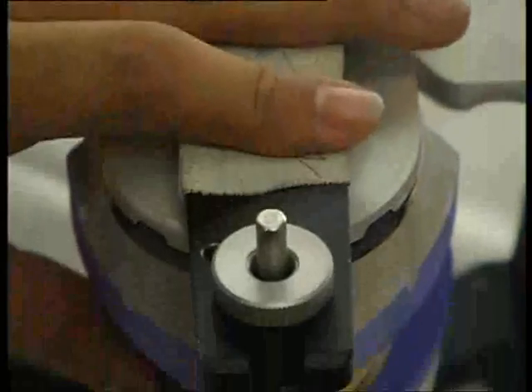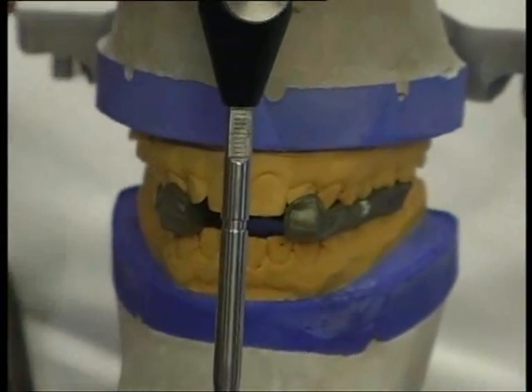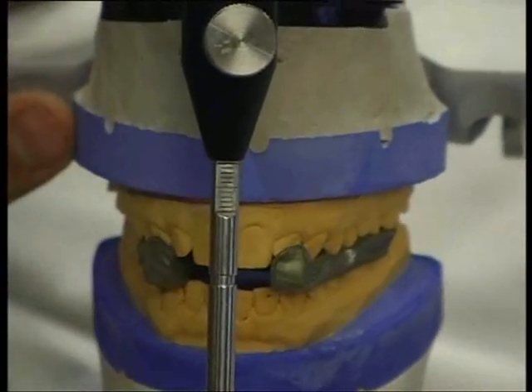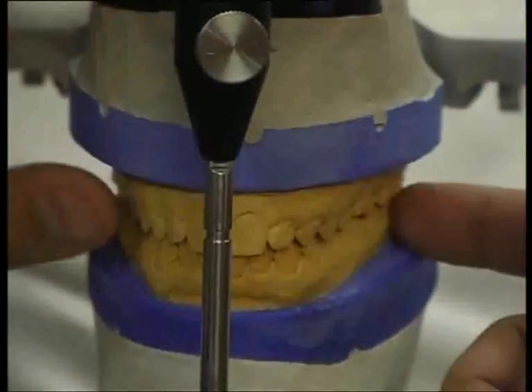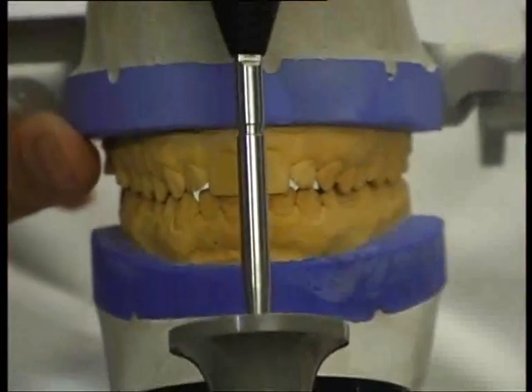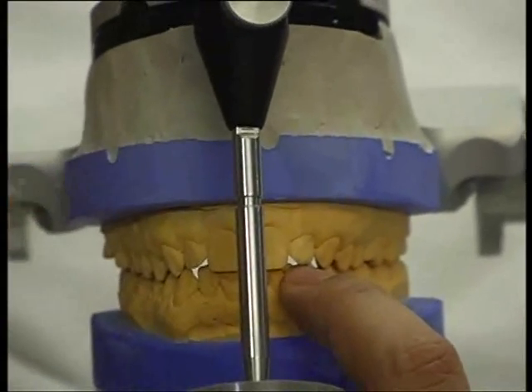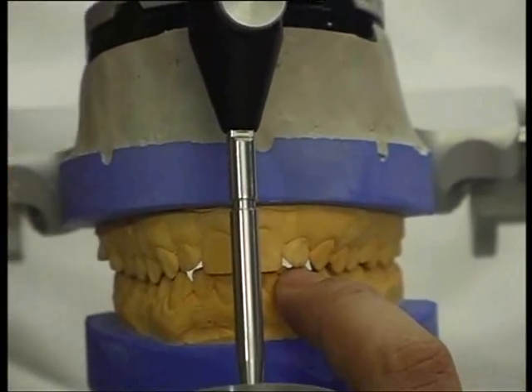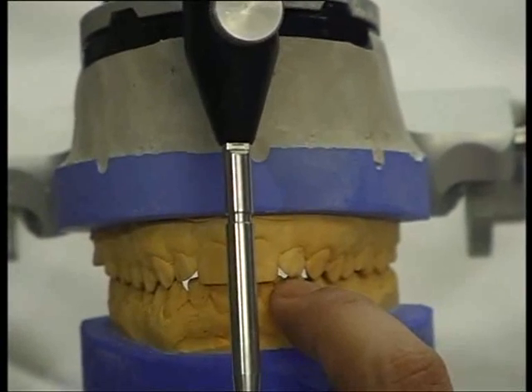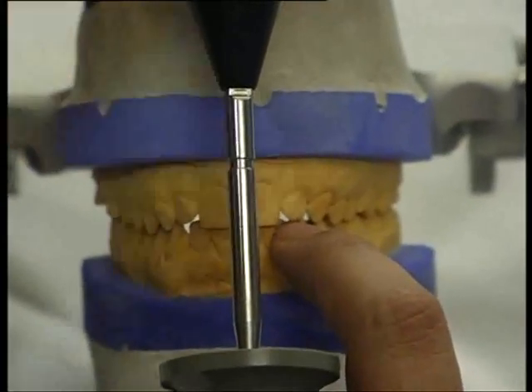Let's go back to the centric record — we've understood this aspect clearly. This is my CR record. This was a case with worn-down dentition and I had to add vertical dimension. I remove this CR record and abruptly drop the vertical, and there is some tooth at the back which contacts, leaving the anteriors relatively open. This much opening I can add without altering the vertical dimension of occlusion, without altering the length of the masseter muscle.